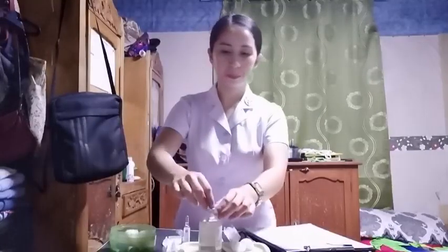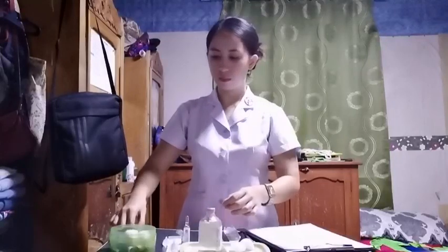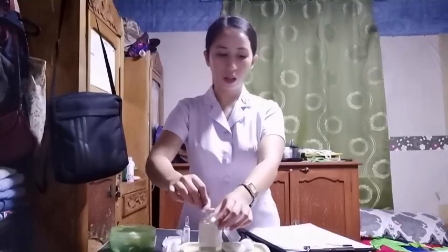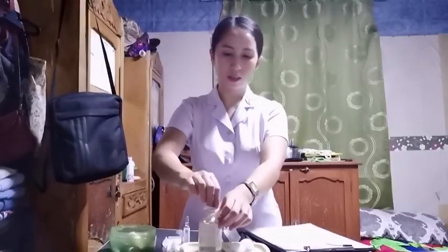Now we can open the medication vial. We should clean its surface with a cotton that has been soaked in 70% alcohol. So do this at least 30 seconds.